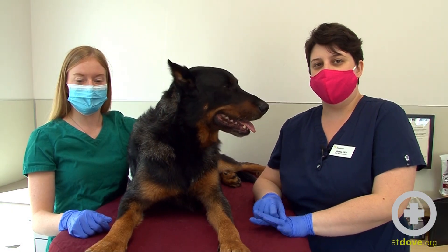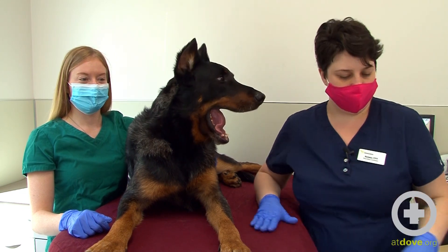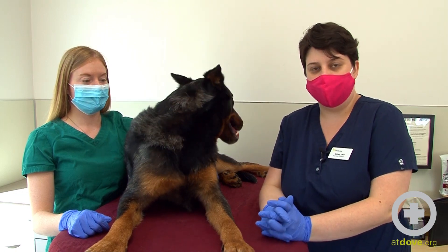Hi, I'm Kelsey. I'm the Blood Bank Coordinator here at Dove Lewis, and today we're going to take a donation from Aegis. We are going to be collecting whole blood using a system that is closed and already has an anticoagulant in it.